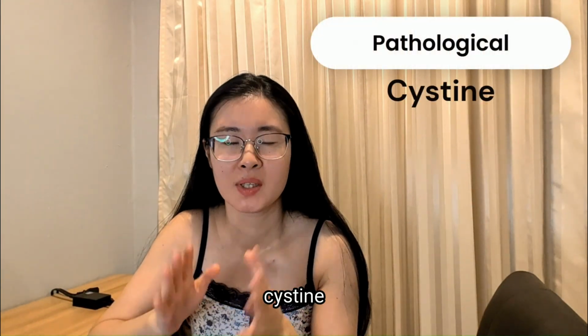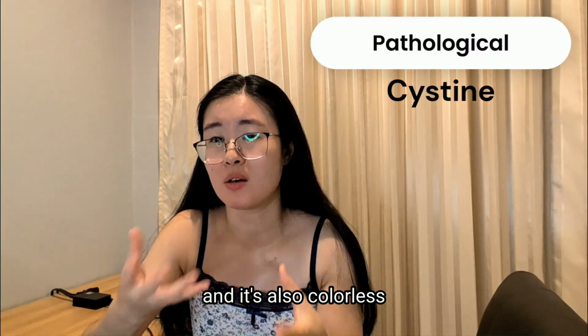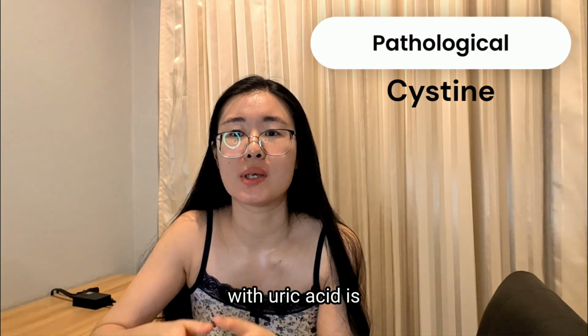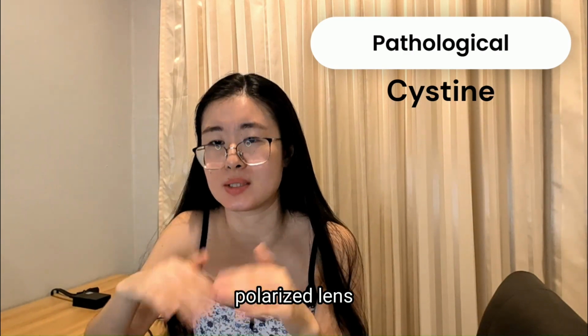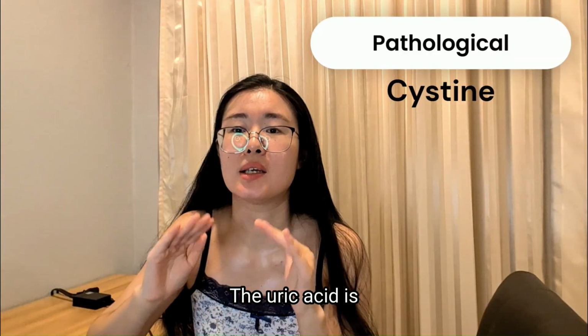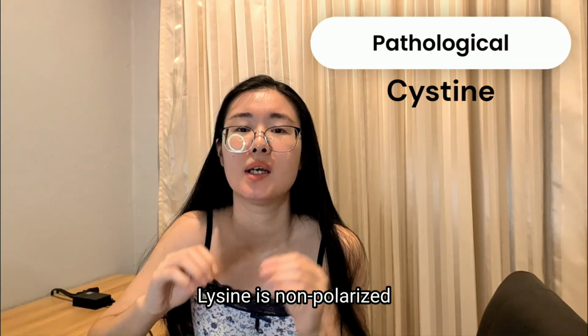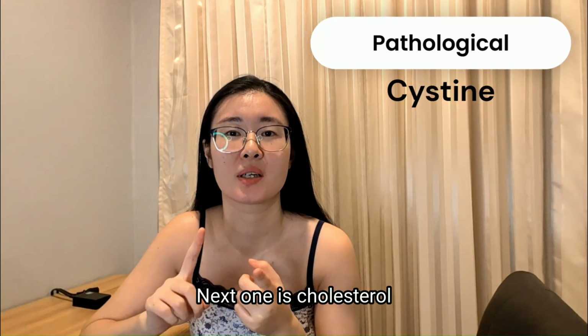First, cystine. This one also has a hexagon shape, and it's also colorless. The only way you can differentiate this one from uric acid is putting it under a polarized lens. The uric acid is polarizing. Cystine is non-polarizing, and this cystine is pathological. Next one is cholesterol.